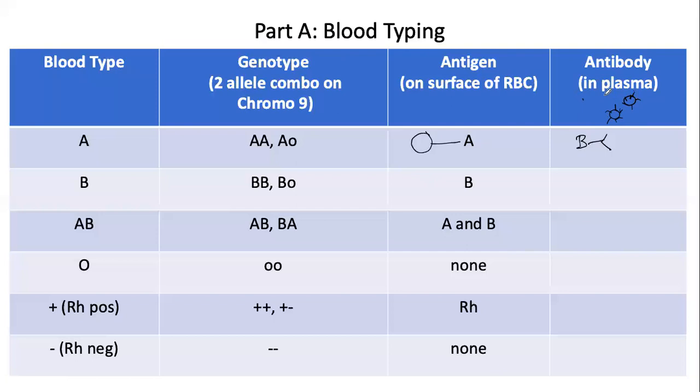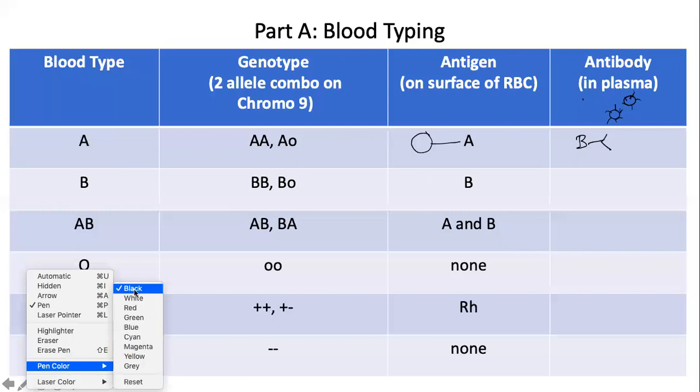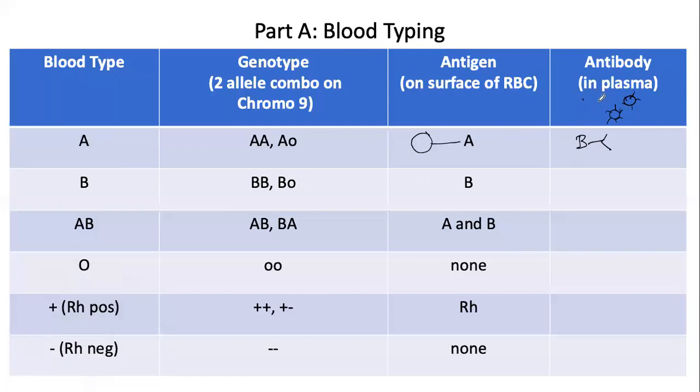So how does that actually work? That antibody, let me change the pen color so you can see it, is going to bind the coronavirus. So here's my sideways Y, right? There's my antibody. And this antibody is specific for coronavirus, right? It's not going to bind bacterial pneumonia. It's not going to bind spinal meningitis, right? It's specific for corona, COVID-19 more specifically. So that specific species of virus.